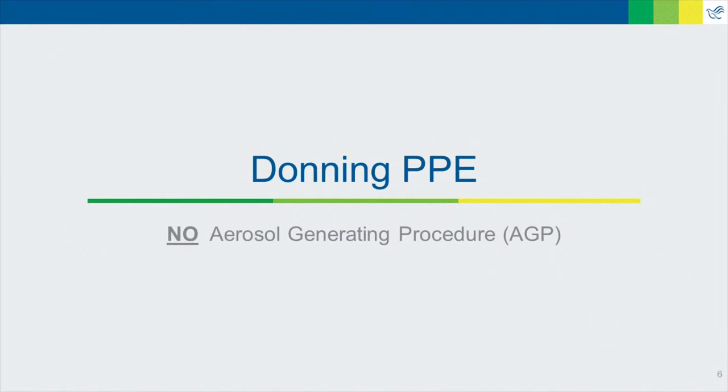Now let's watch a demonstration of donning and doffing with special contact droplet precautions.